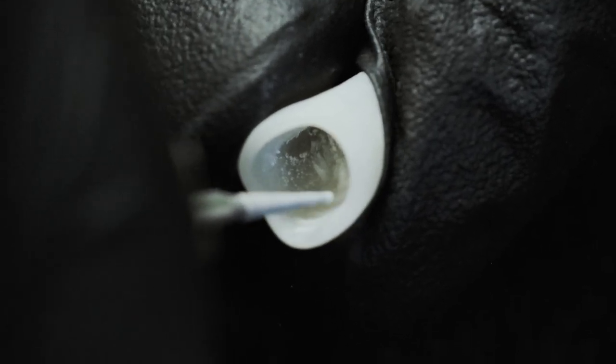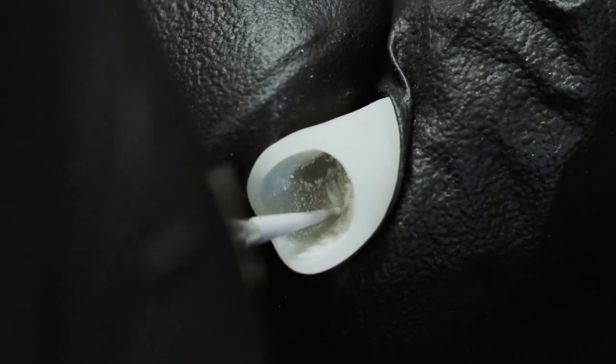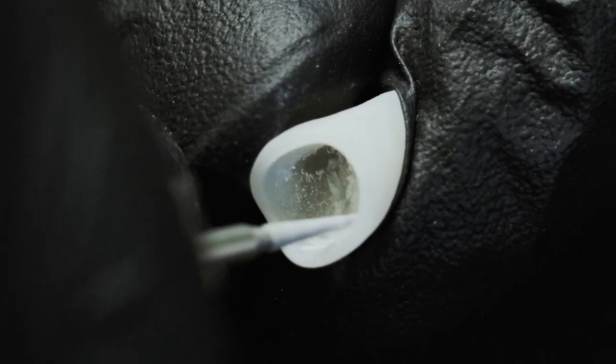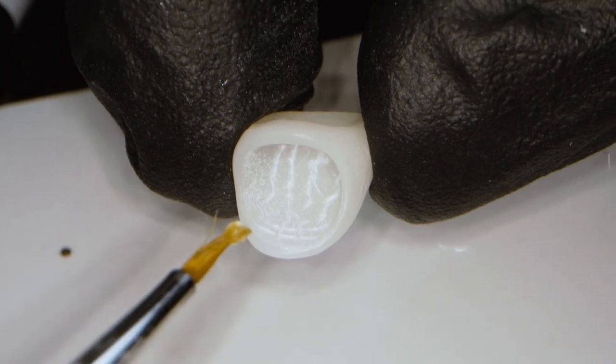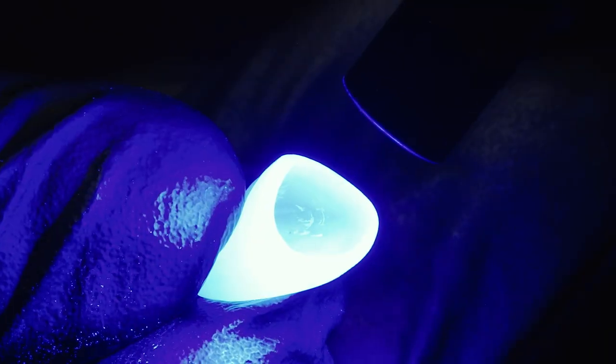Depending on how intensively I want to set the accents, I treat the inside with a diamond bur to get space for the appropriate color. After removing the sand and dust, I apply a very thin layer of Edelweiss bond and light cure.